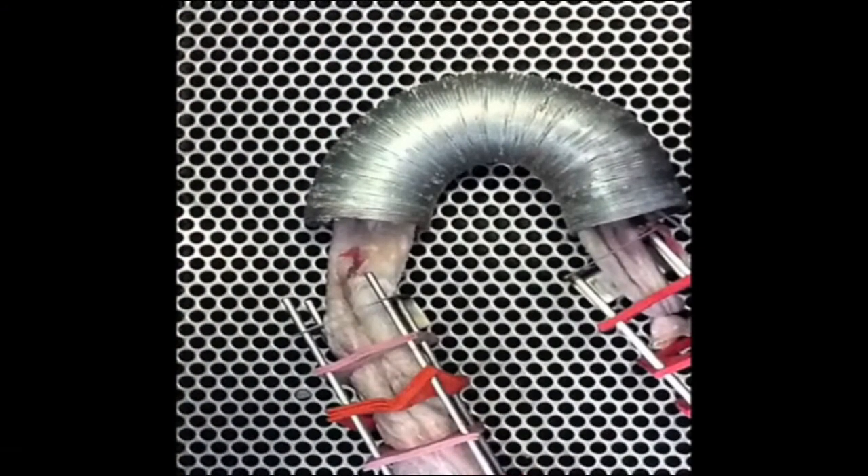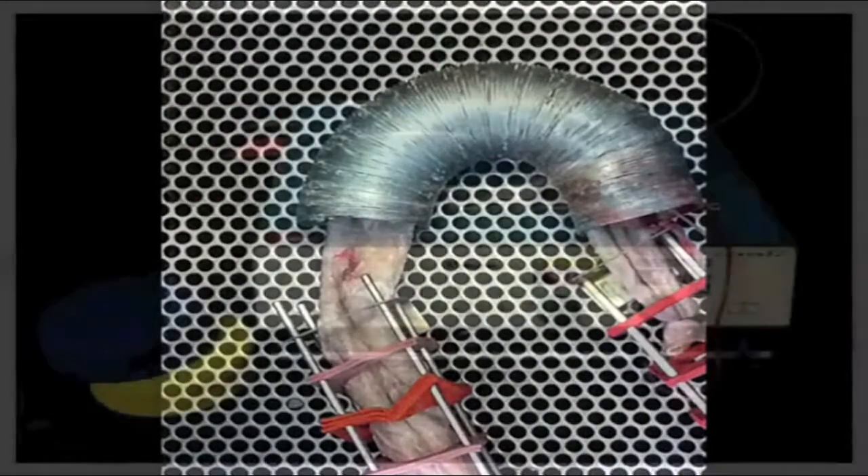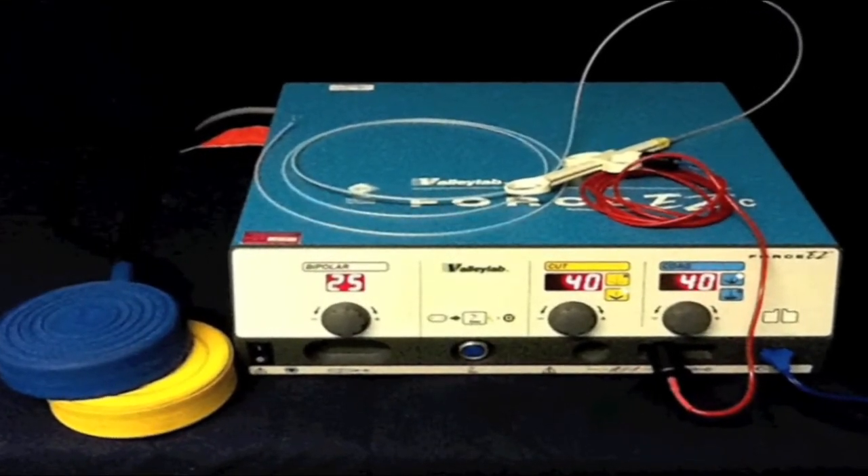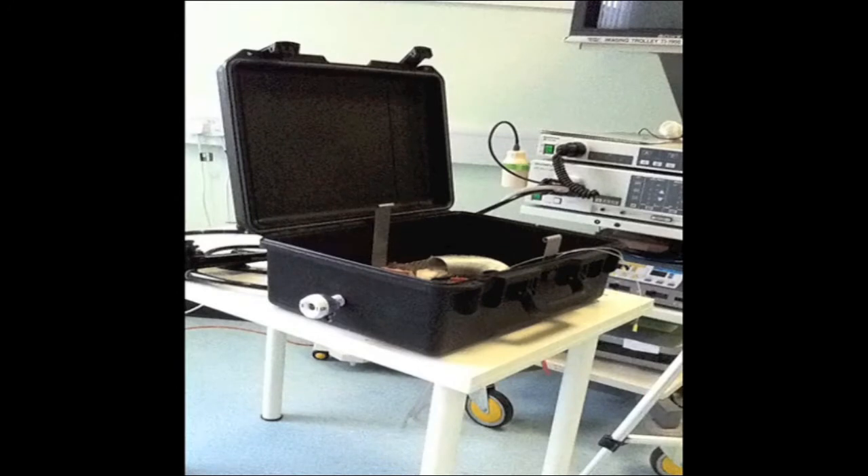Inside the suitcase, we place a removable metal mesh. This accommodates a crocodile clip, which is connected to a diathermy unit. Once the simulator is set up, standard colonoscopy equipment can be used to complete the simulated polypectomy.